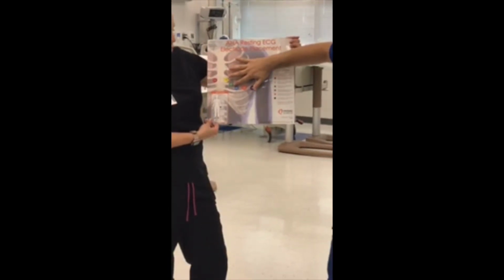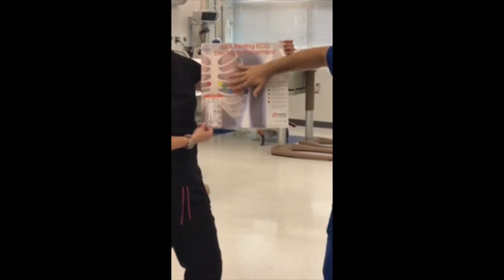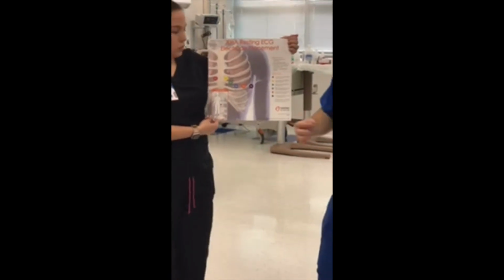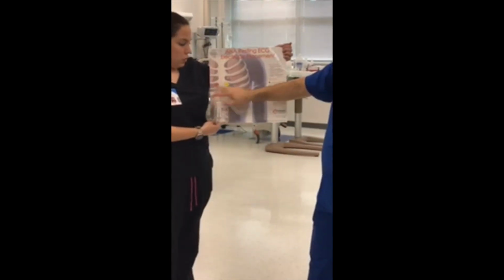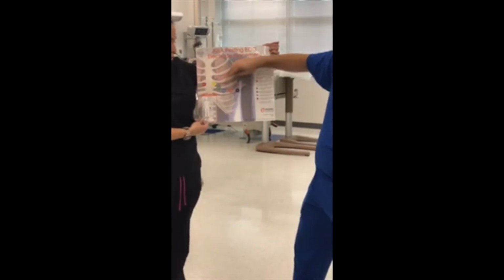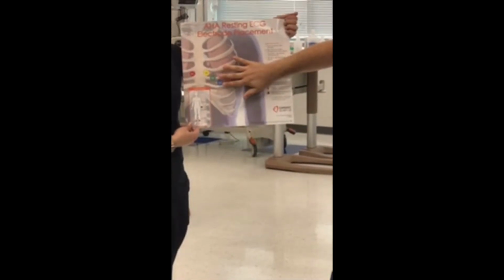V3 directly below, a little bit off to the side. V3 is sometimes placed on the bone as such. Again, if it can be avoided, great, but that one's okay per American Heart Association instructions. V4. V4 is in the fifth intercostal space, just one more down.